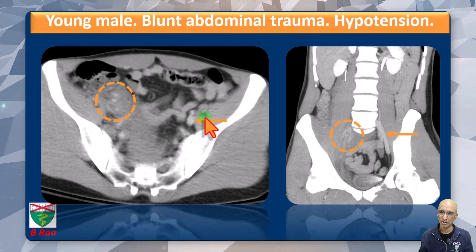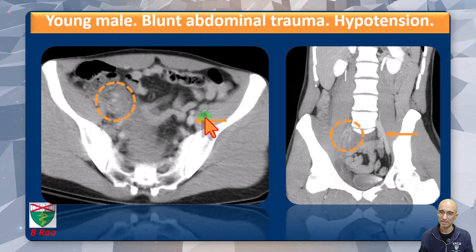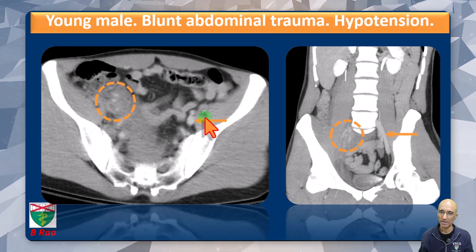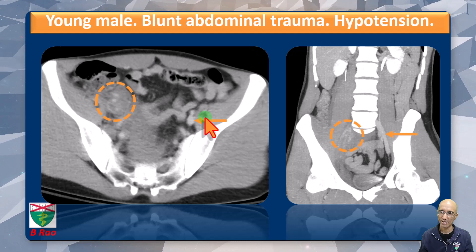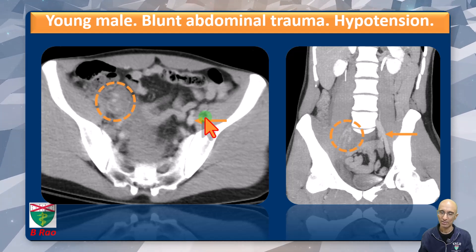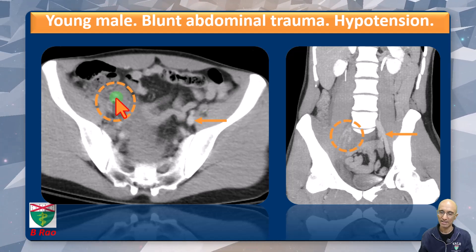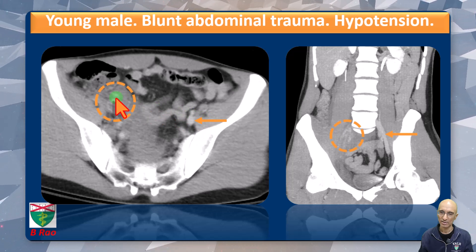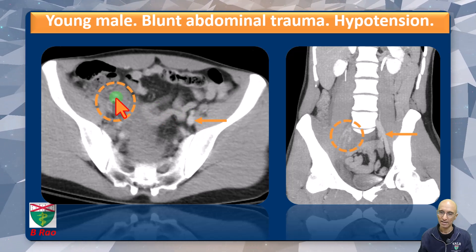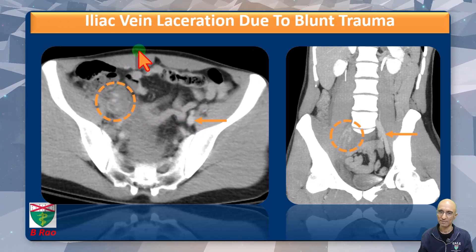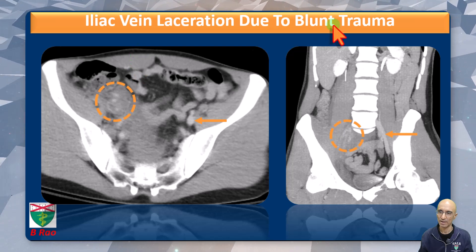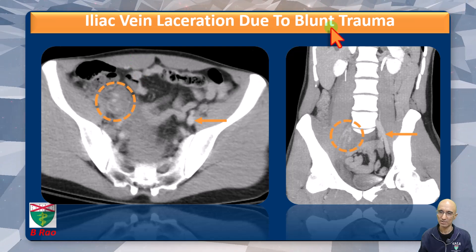On these snapshot images we can see the contralateral normal appearing common iliac vein and normal left common iliac vein, but on the right side there is active contrast extravasation from the iliac vein. Appearances are consistent with iliac vein laceration due to blunt abdominal trauma.